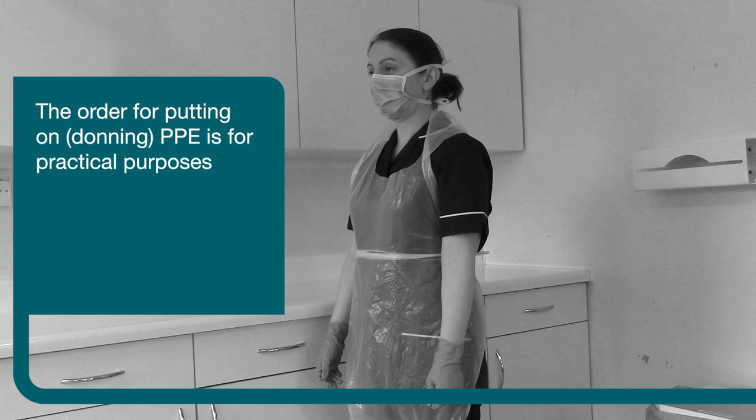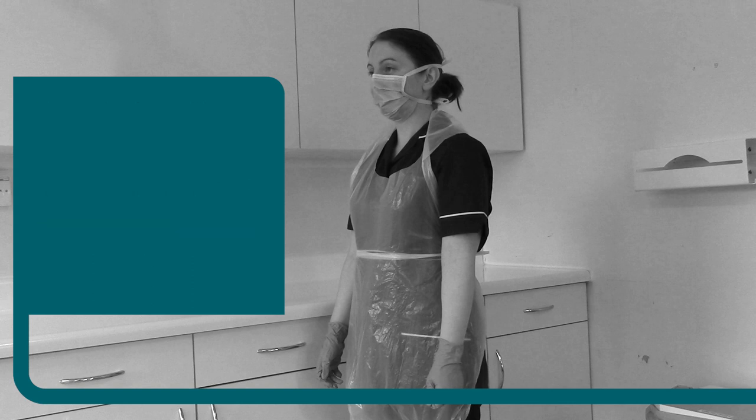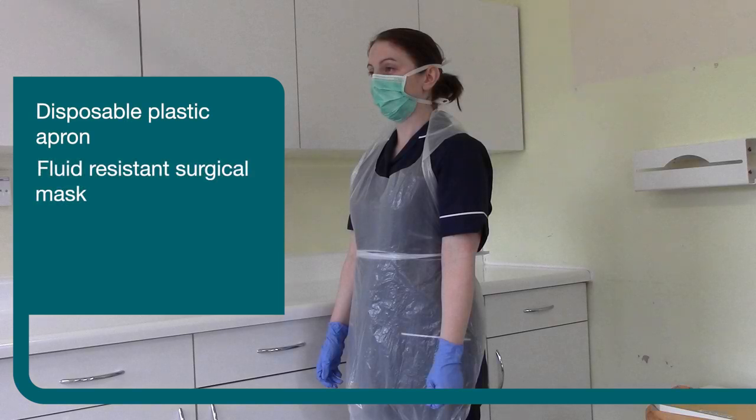The order for putting on PPE is for practical purposes and is less critical than the order for removal. The items of PPE required are a disposable apron, a fluid-resistant surgical mask, and a pair of disposable gloves.